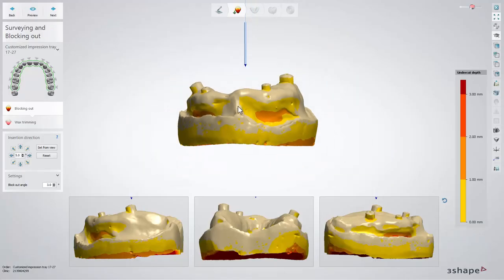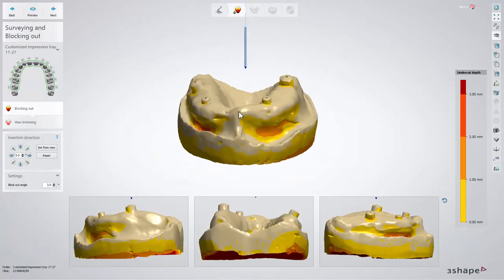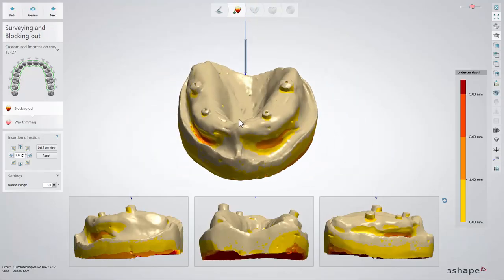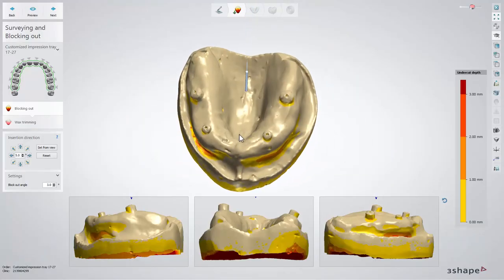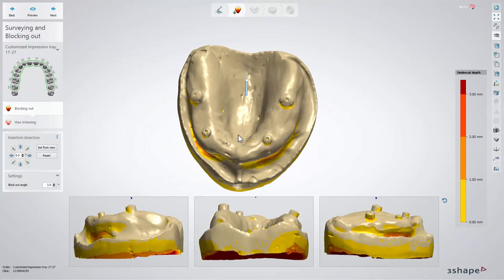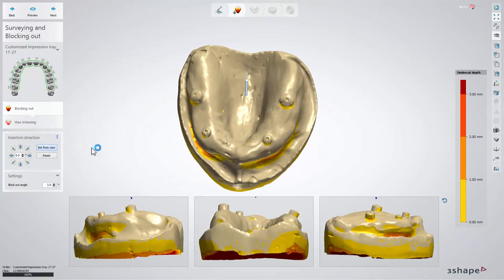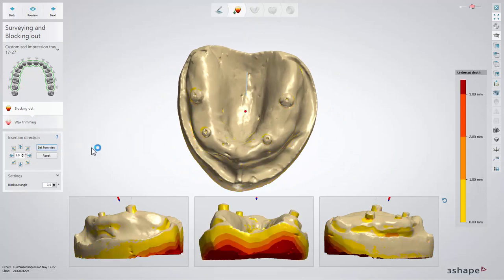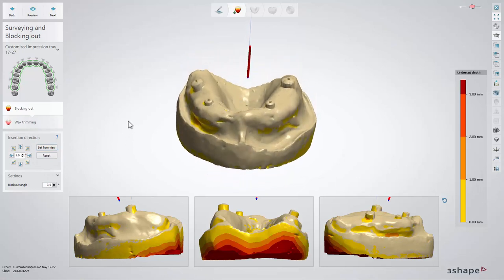At this point choose an insertion direction by placing the model in the correct position and click the Set from view button. Wax will be applied automatically to block the undercuts.